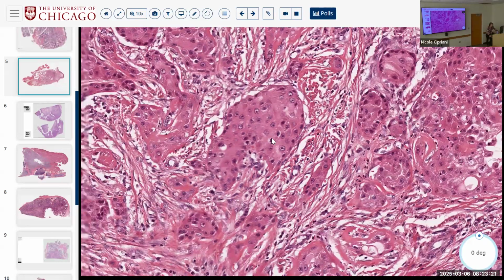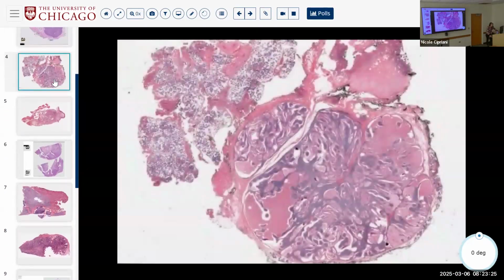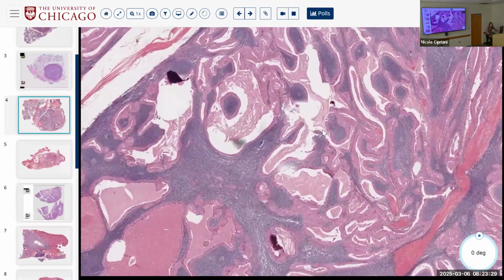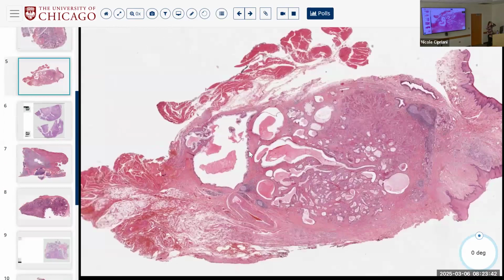And so there are variants of mucoepidermoid carcinoma that are rich in more oncocytic types of cells, okay? This is not it, this is just a regular Warthin tumor, right? But you can have a Warthin-like mucoepidermoid carcinoma in which you have prominent lymphoid stroma, in which you have oncocytic epithelium, but also, probably, the presence of mucocytes.